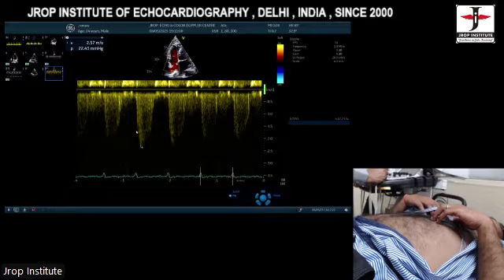Okay. Can't we take measurement at that video where we can visualize the pulmonary artery? No, tricuspid velocity, not pulmonic artery. We are looking at tricuspid velocity. Yes. Thank you, sir. Pressures.